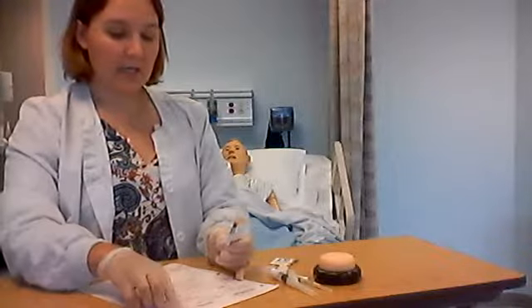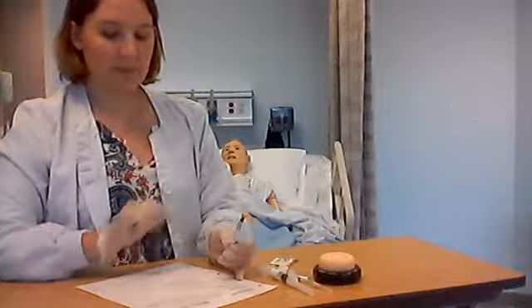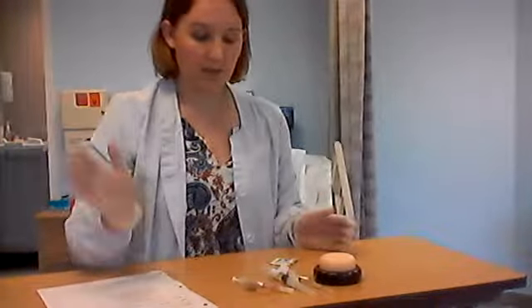Then for my TB, I have Terrence Walker, tuberculin purified, 0.1 milliliters intradermal. Time is now, I will document at the end. Okay, so now we're going to go ahead and give the injections. Our 3 checks are done.